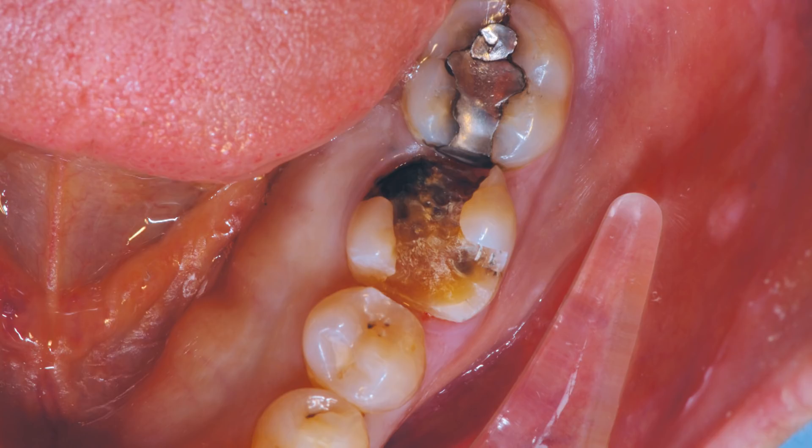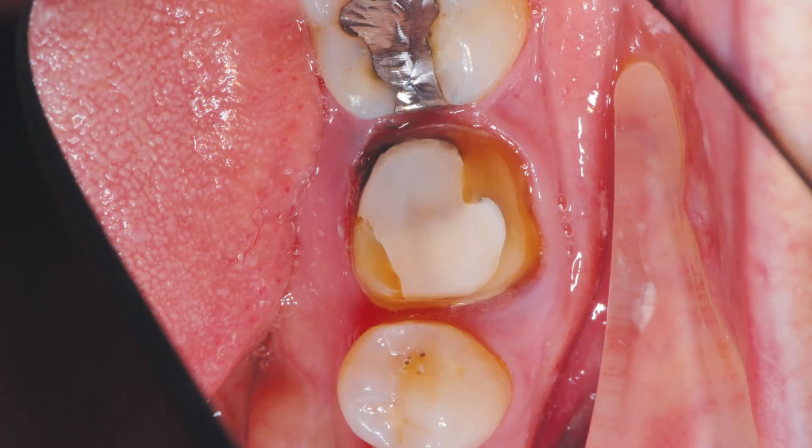To begin the tooth preparation, the old amalgam was removed, exposing sound tooth structure. You will note the amalgam-stained dentin in the distal lingual area. One of the advantages of being able to deliver a Bruxer Now crown is the conservative preparation requirements for the solid zirconia material, which allows for a 0.7 millimeter minimum reduction, thereby preserving the tooth structure.